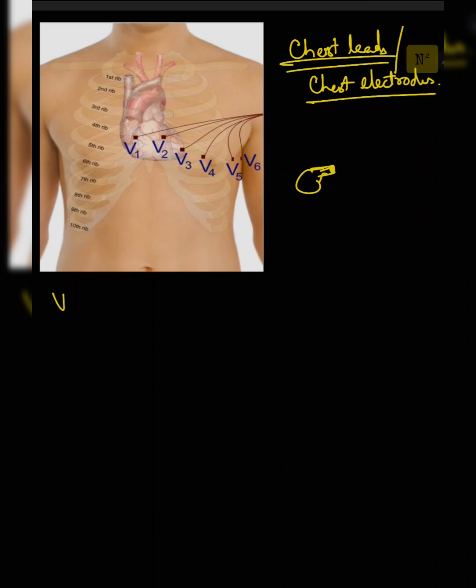around the ribs. Okay, so this is the diagram depiction of the relative position of the ribs, showing the relative position of the heart in the body in an anatomical position. So these lightly shaded, curve shaped areas are called the ribs. Now take for example this area, this V1. This black square area is showing you the area where the V1 is.